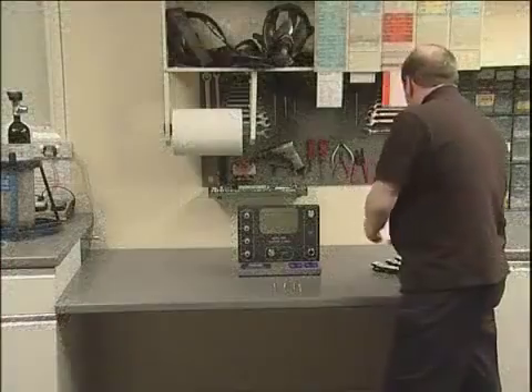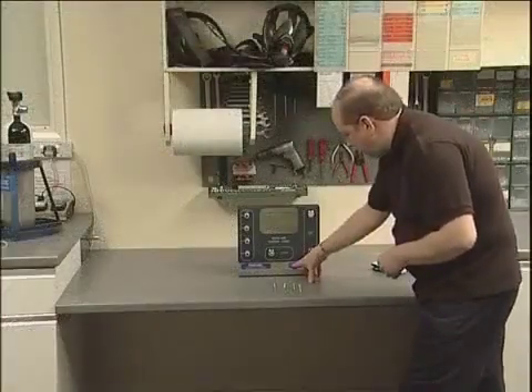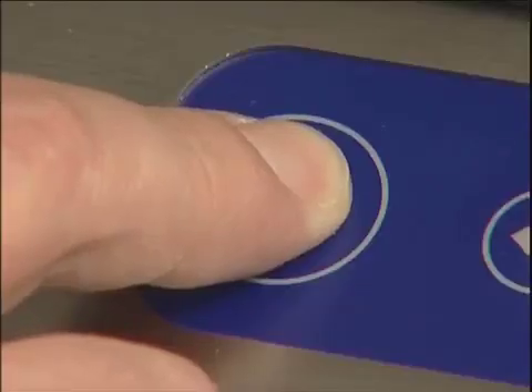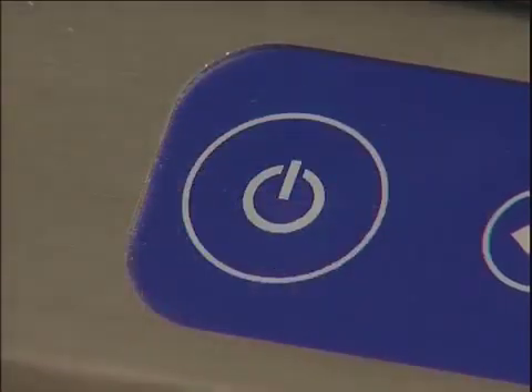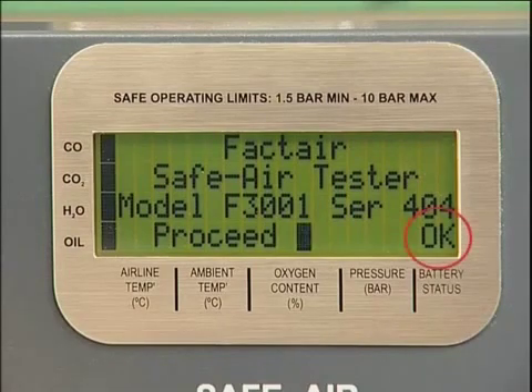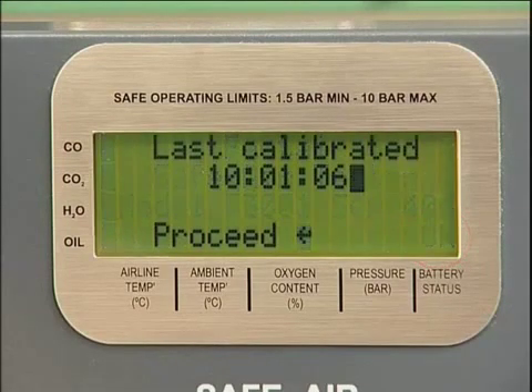To carry out a test, first switch on the machine by pressing and holding the on-off button on the keypad for approximately two and a half seconds. The display will show both the model and serial numbers. If the battery condition is OK, press Enter. Press Enter again to acknowledge the date of the last calibration.